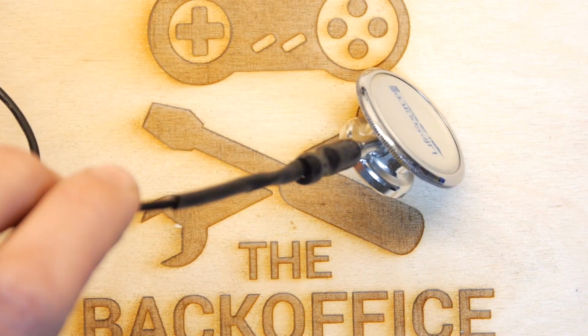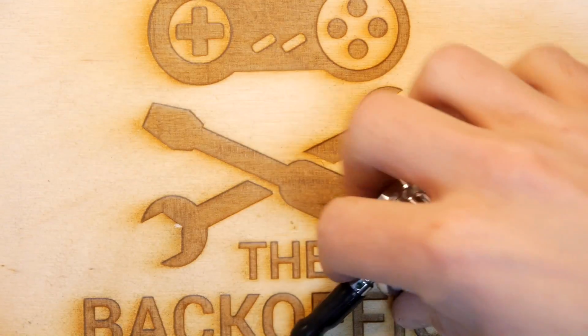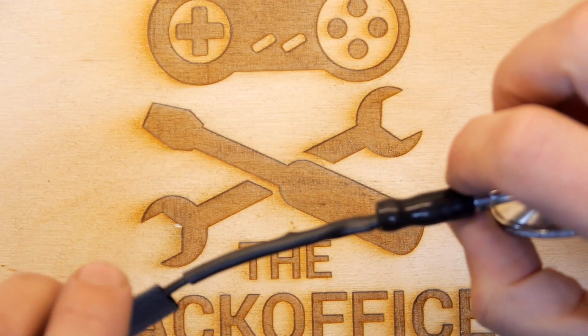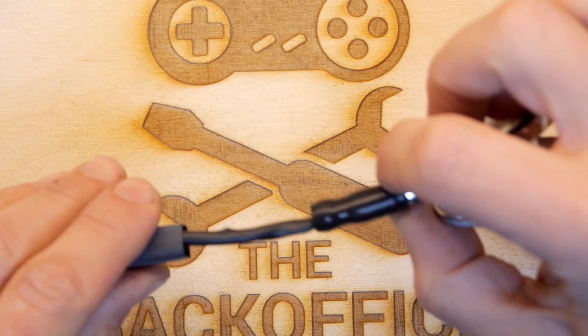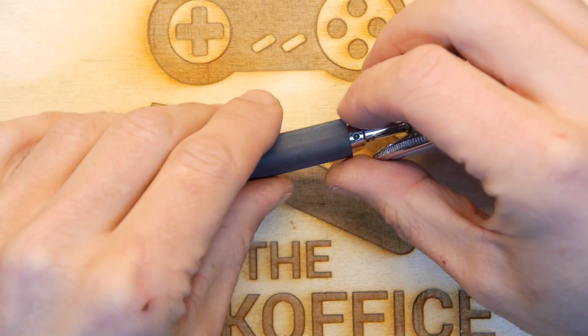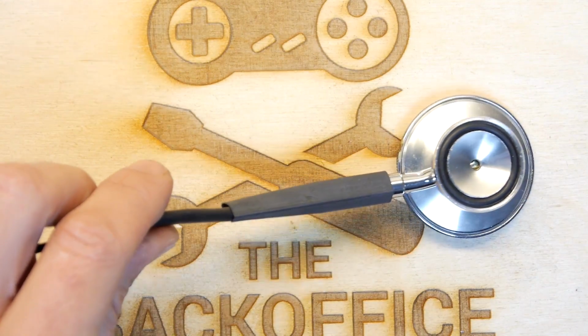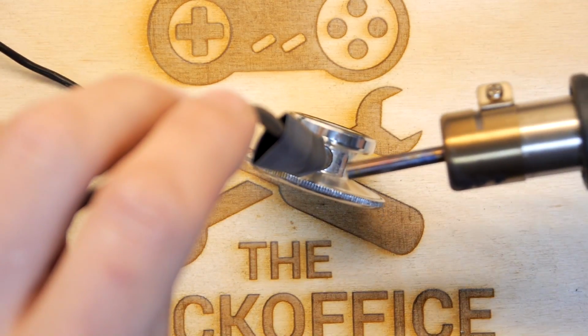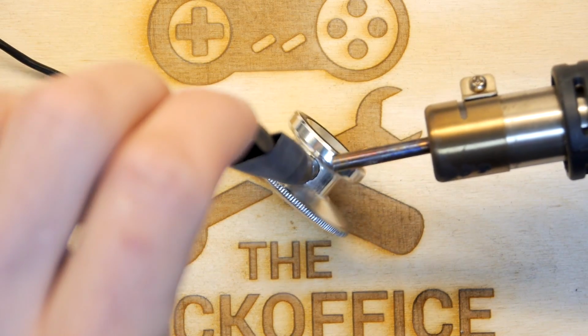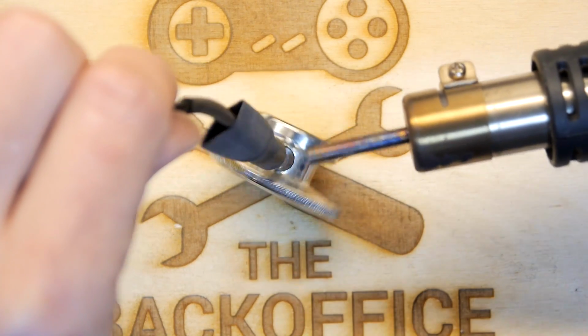The inner layer. A bit more cautious now. I don't want to damage the stethoscope drum.